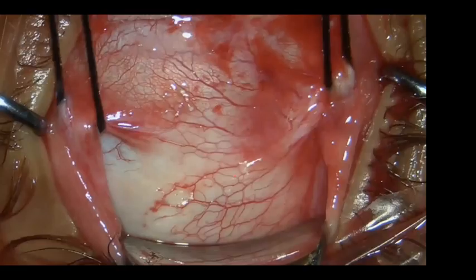At the time of the surgery, these are some surgical tips. I need to open the conjunctiva. I make a large incision in the conjunctiva extending from the superior rectus to the lateral rectus, if I'm going to operate on the upper temporal quadrant, which is the majority of situations. And I usually adjust my microscope so that I'm facing this quadrant, which will make the work easier for me.